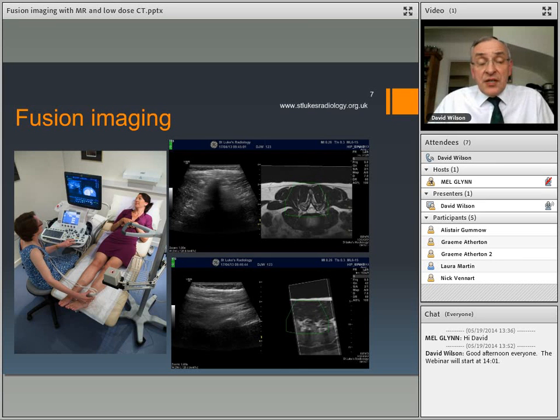At first, it took me at least quarter of an hour, and there's some pitfalls and tricks involved in it. And anybody starting this, I advise you to work with someone who's done it before to learn the vagaries of the machinery you're using. Several of the big manufacturers produce the equipment. We happen to be using General Electric, but I know Hitachi and Toshiba, very good systems as well. And I believe some of the others are coming online very shortly.